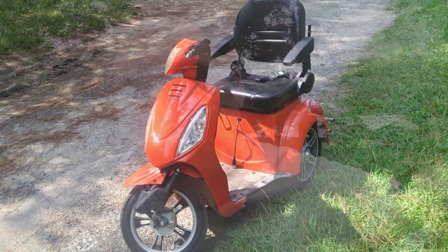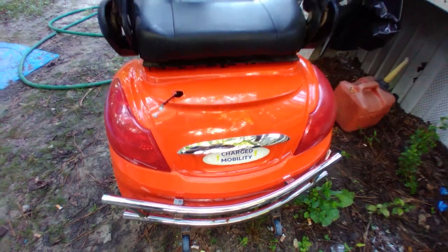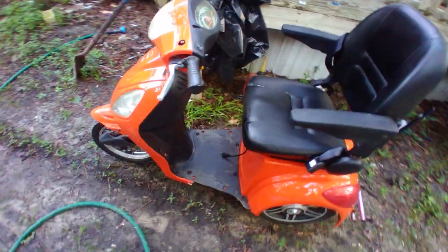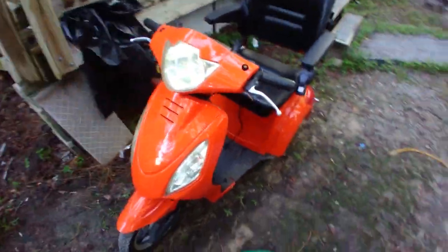Hey y'all, good afternoon and welcome to a hot day here on the homestead. Today I'm working on this little mobility scooter for a friend of mine. His mother lives exactly a quarter of a mile behind his house and they have a very nice paved walkway that she can walk back and forth.